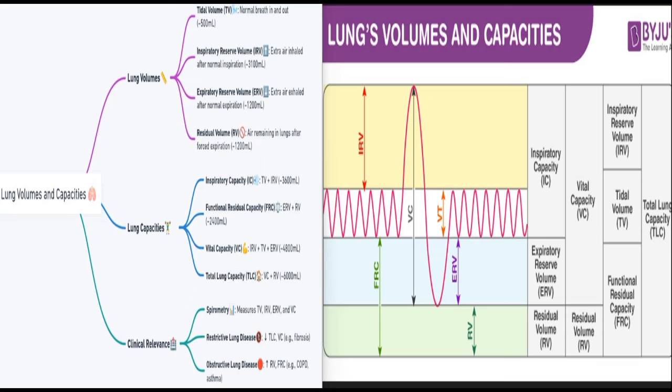And with the ratio 81%, lower limit of normal being 71%, the FEV1 FVC is above the lower limit of normal and also within the normal range, so there's no obstruction present. So in an example like that, it's likely normal spirometry, with no significant restriction or obstructive pattern.